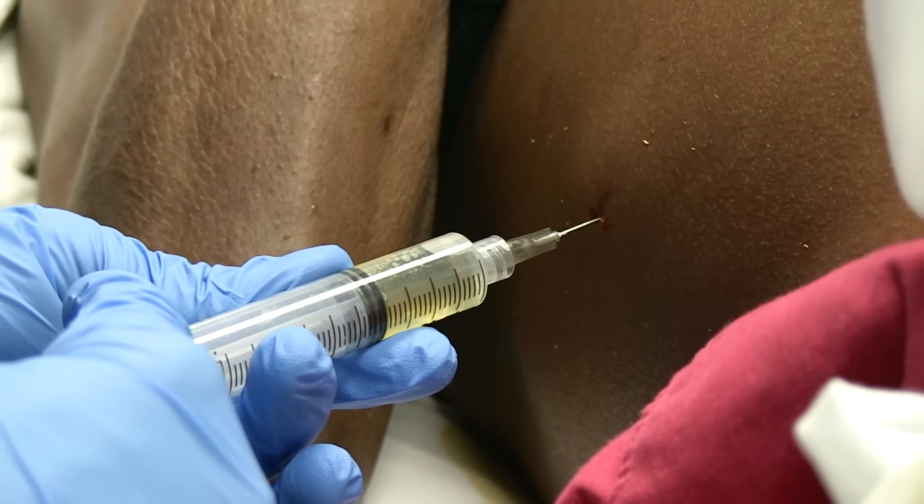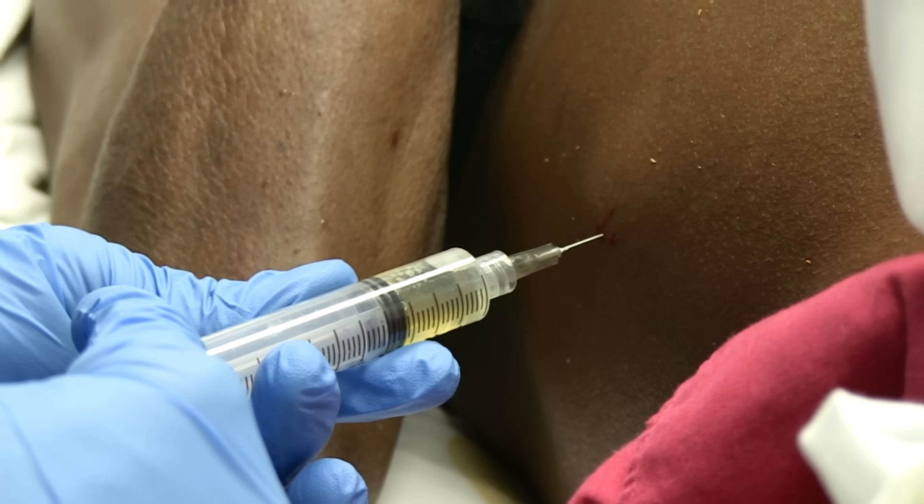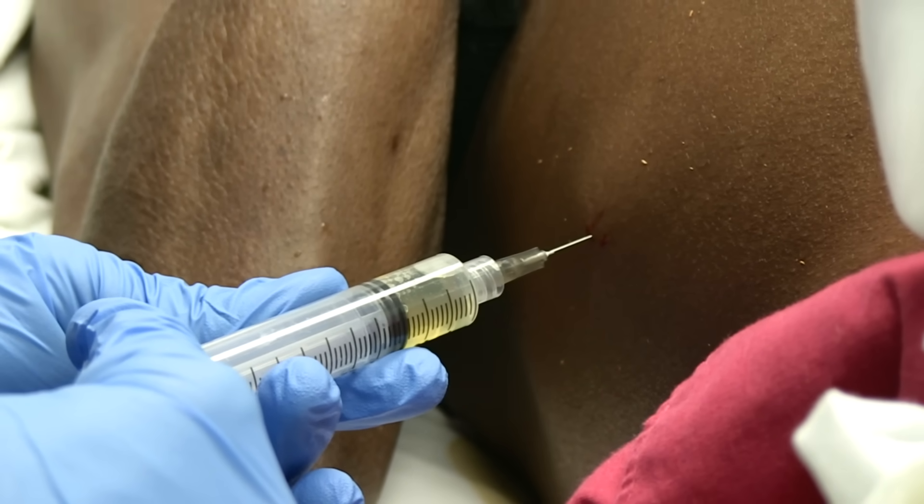Also, you get another idea — beyond the measurement we just made — of how deep you should go before you expect to reach the peritoneum.